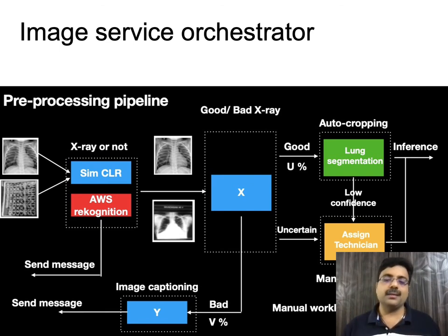In fact, one of the finer points of evolution of the product could be customized recommendations instead of generic feedback. And this may actually become overarchingly important as the service evolves to other kinds of teleradiology and not just X-ray image interpretation. This is definitely one big area of product evolution that will have to end up relying on some very good AI at scale. X-rays that are reasonably okay, but not really good, are sent to manual review by a technician.